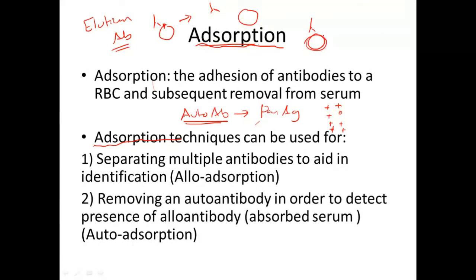طيب، so تذكرون لما قلنا أن البيشنت ممكن يكون عندهم cold antibody وممكن يكون عندهم warm. طيب، cold antibody we talk about some technique. For example, we have to select some potentiator, not other. We can omit immediate spin. We don't do it. We can pre-warm السيرم.